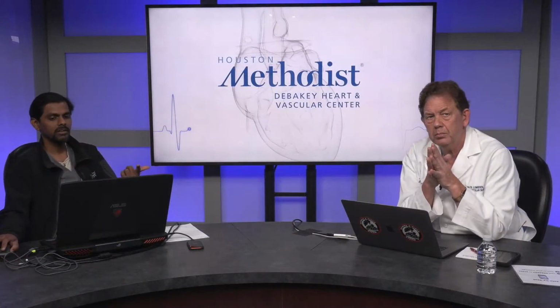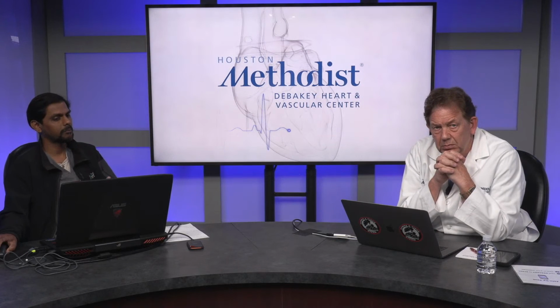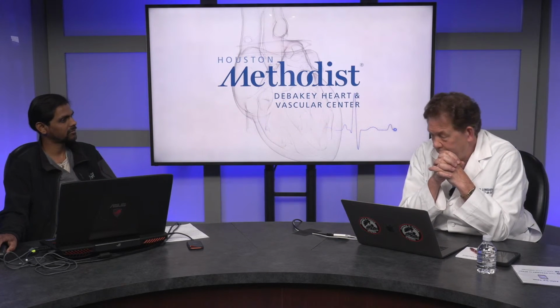If there's a big delay between the dye arrival times and the contrast flushing down the aorta, it's probably coming through a circuitous route, and so it's a type 2 endoleak. Yes. So these dye arrival times are something that we don't really think about in vascular surgery, but all that information is available. Yeah, especially in a dynamic disease process like dissection and endoleaks, these time attenuation curves can really help with improving the accuracy of our diagnosis.